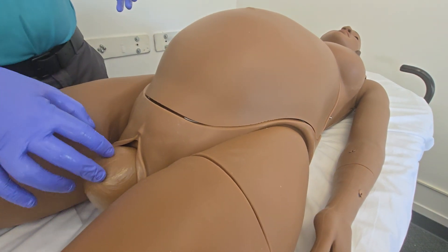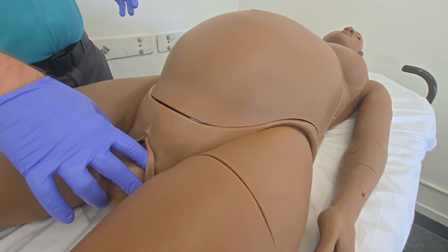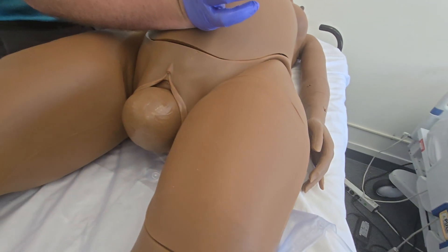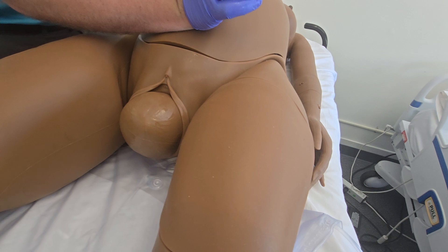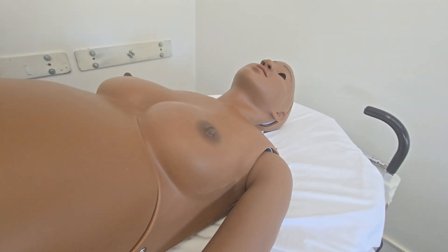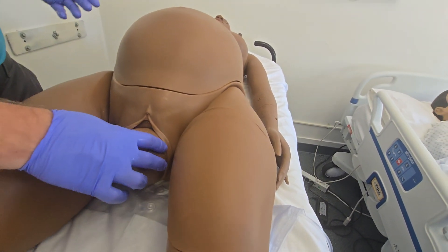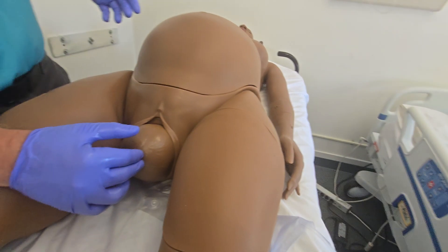That pumping air noise shouldn't normally be happening. I may not have secured it properly — it's still detecting the belly module as on, so it was able to do the actual delivery, but I just may not have latched it all the way down. I apologize for that — we'll take a look once we're done. It should not be leaking that much air.